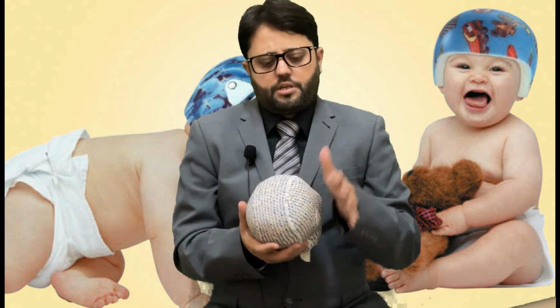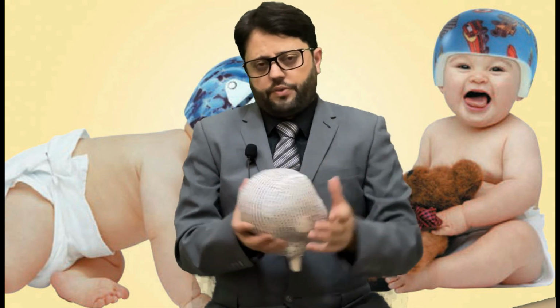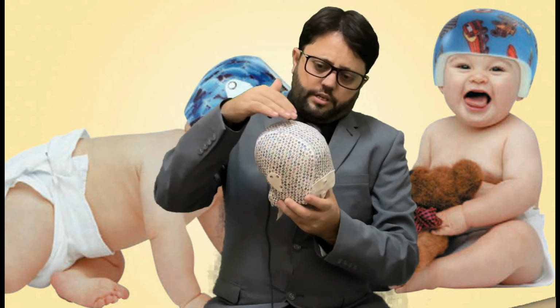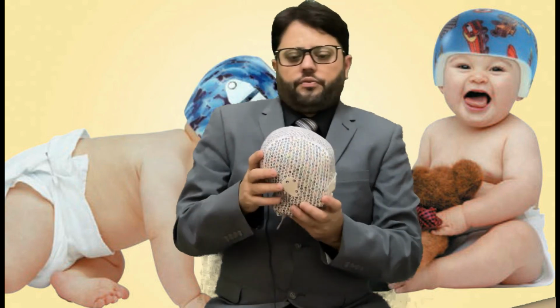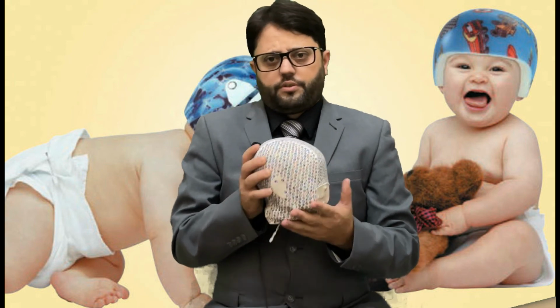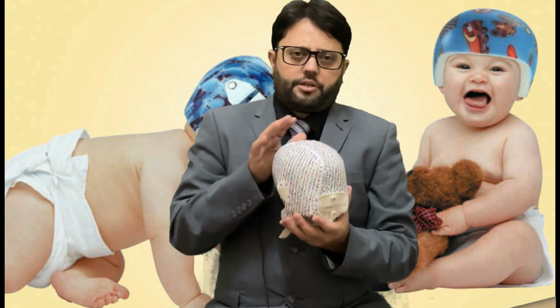We make space on the area which is really flat, where we need growth. We need to close the area where we need to stop the unwanted growth. At the same time, if you observe some patients who have a very prominent cranial vault, it is very prominent from here and goes like a bridge down. We need to cover that area also. When the head grows in the right position, this will automatically come down.